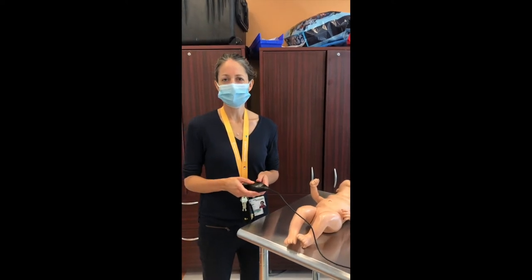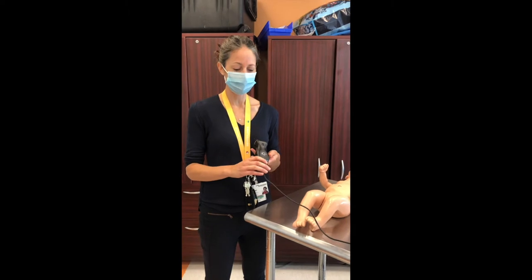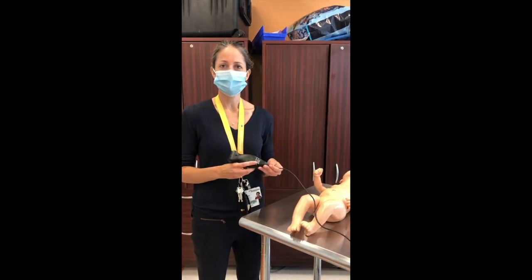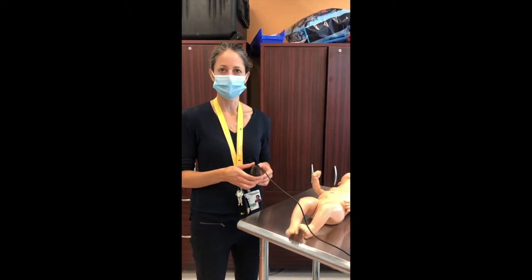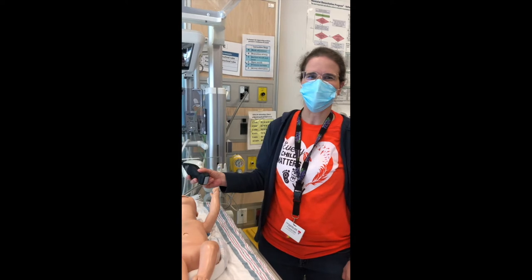Hi, I'm Anita Point, a neonatologist at Chussain-Justine. I'll be presenting how to do the views for the cardiac ultrasound. Hello, I'm Pia Vintermark. I'm a neonatologist at the Munchell Children's Hospital. Today I will be presenting how to place the probe for the brain ultrasound.